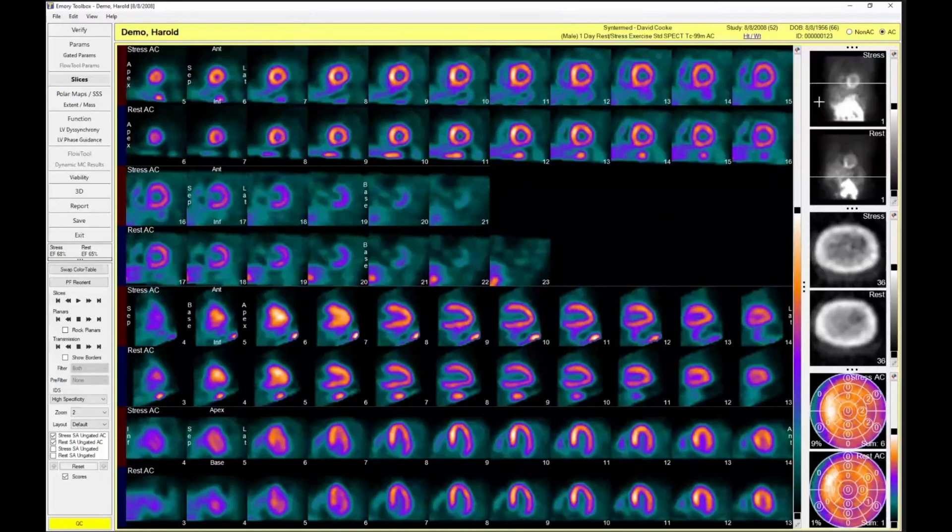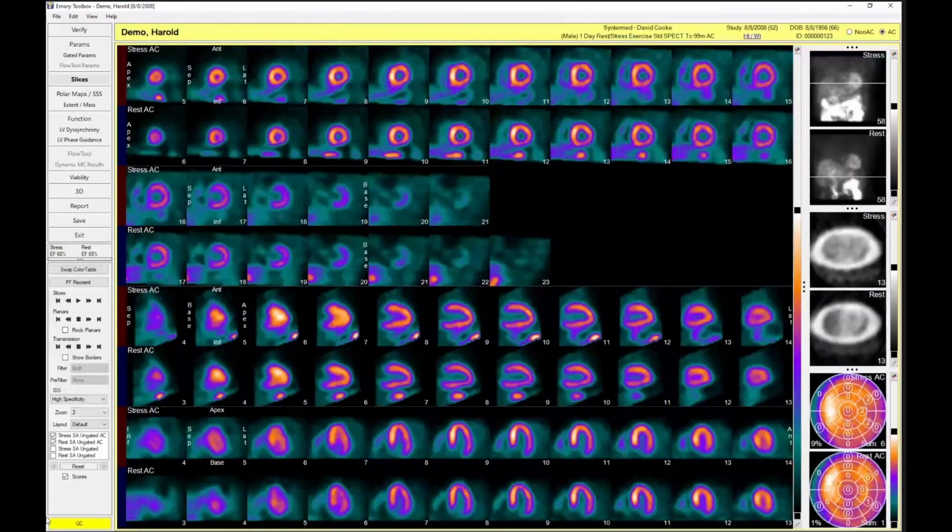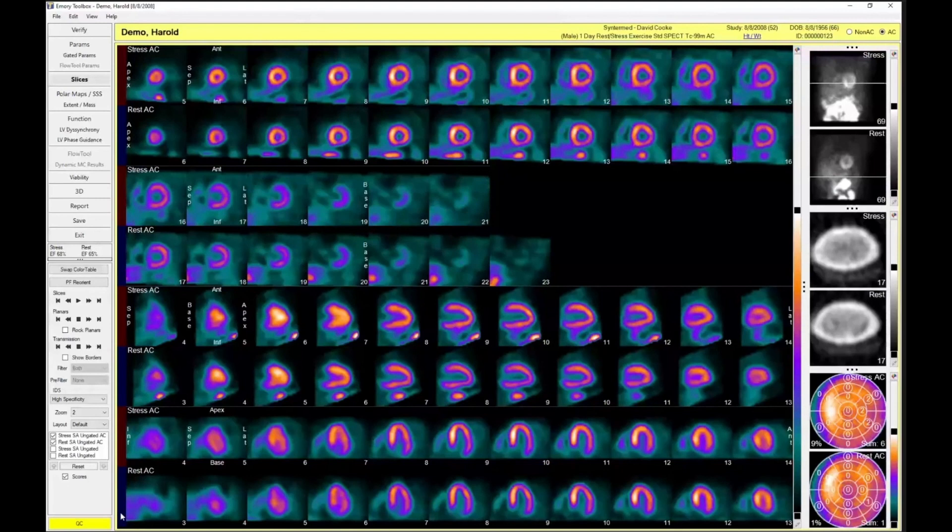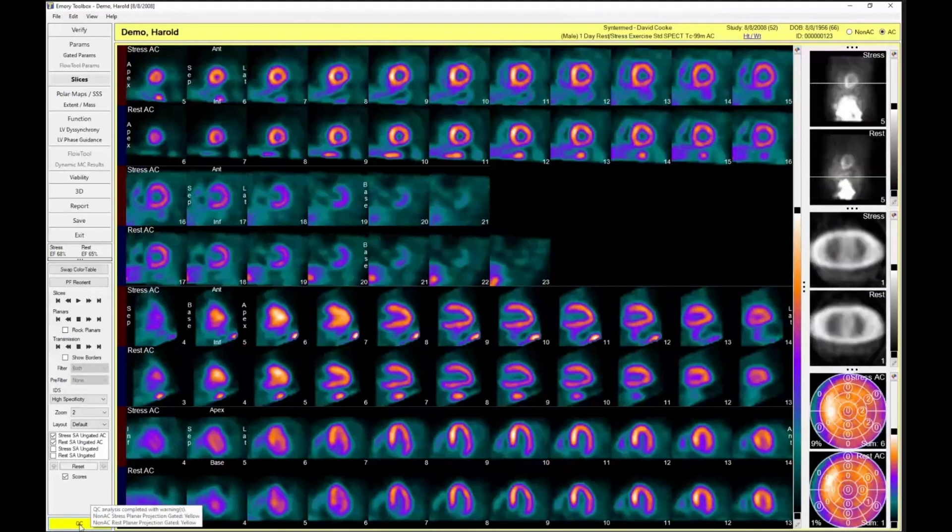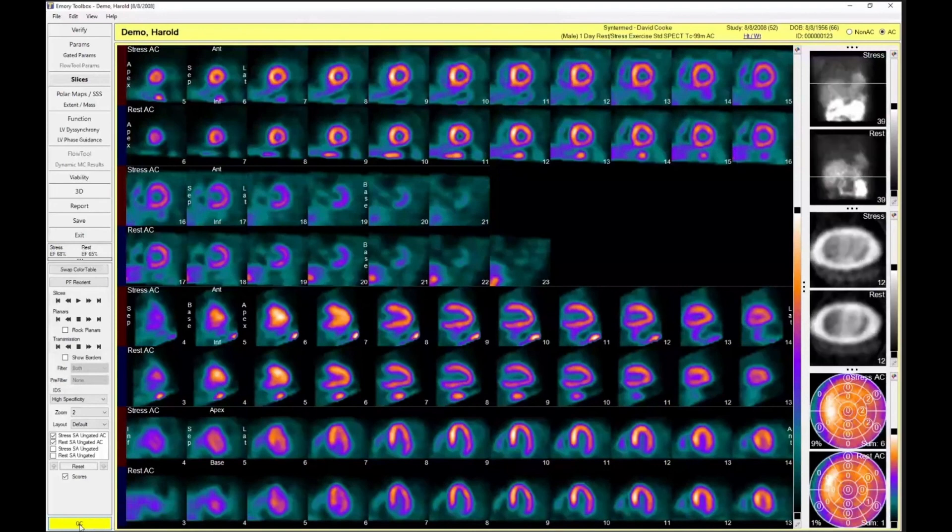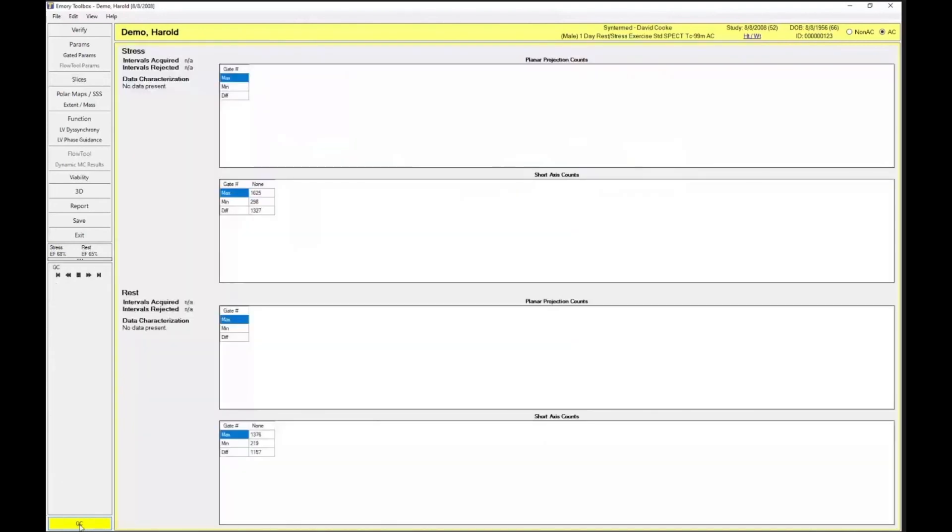But we also do automated QC of these planar projections. You'll see that down here in the bottom corner, and you'll see that it's yellow. So there's like a red, green, and a yellow. Green would be good. Yellow is caution. Red would be that there's a problem.